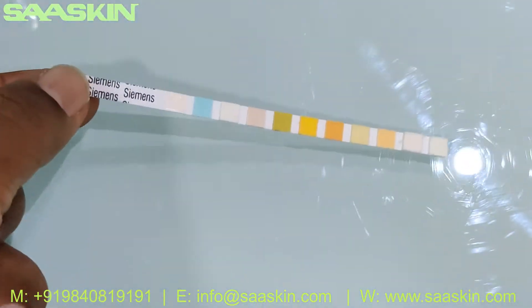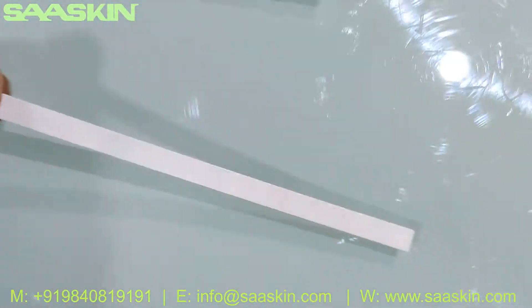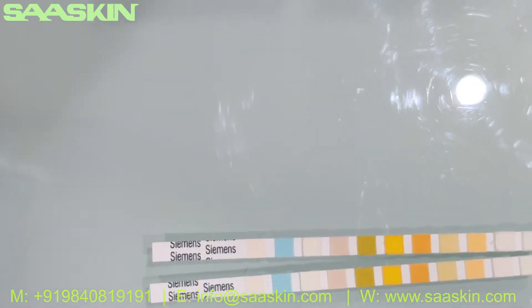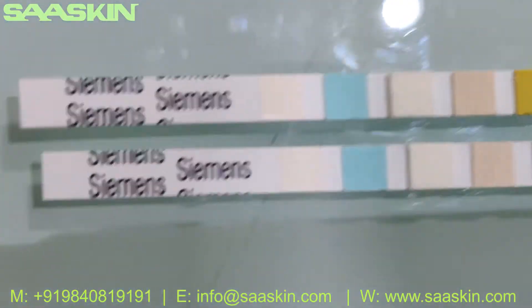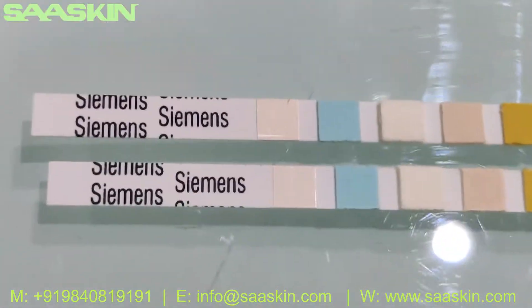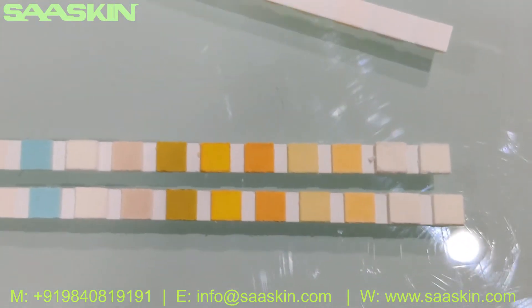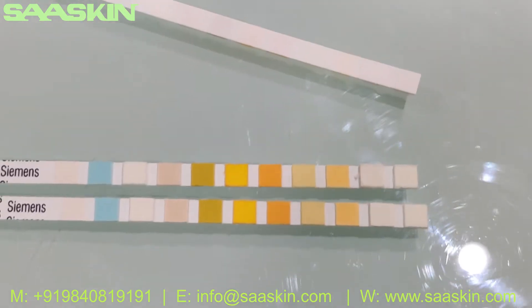Let me take a couple of strips for you. This is how it looks like — one side and the other side, which is a plain side. You can see this is how the strips look. You can see the different color codes for the 10 parameters on the strip.